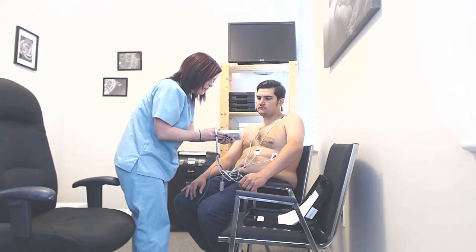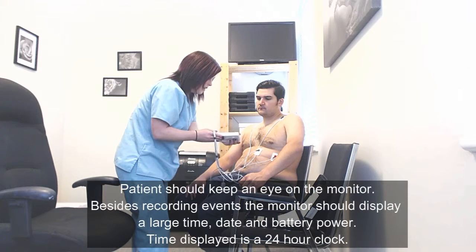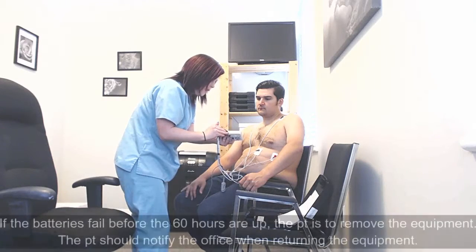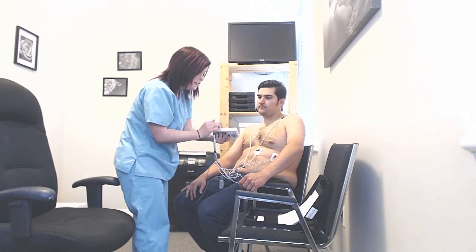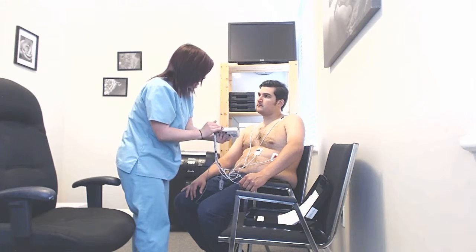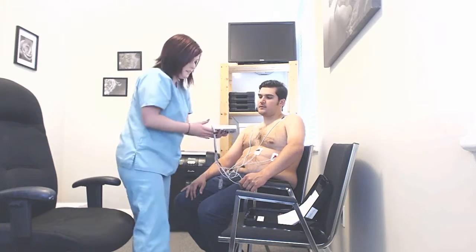I am going to hit record, and then all you will ever see on the screen is the large time, the date, and your battery power. As long as your battery power is over 70% to start, it will last over the 60 hours. If for some reason the batteries die before the 60 hours are up, your screen will go blank — remove the equipment and call the office to let them know.